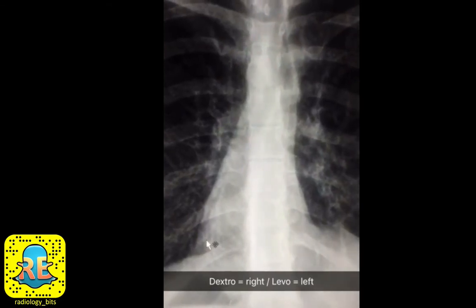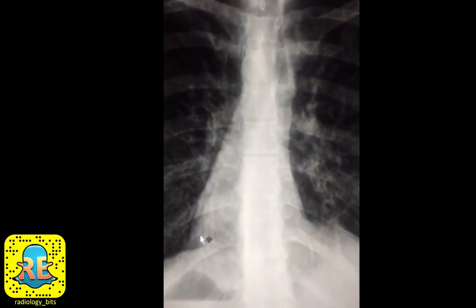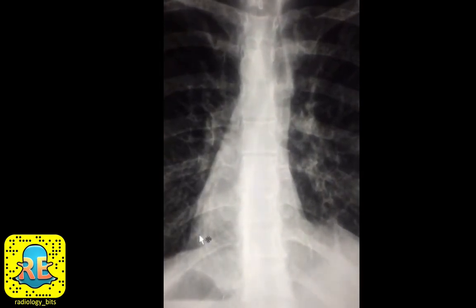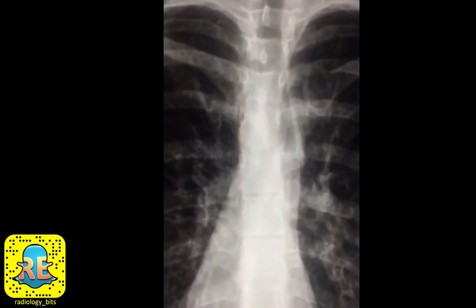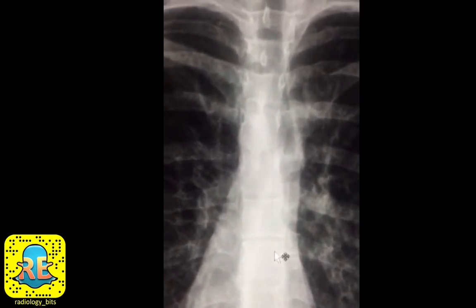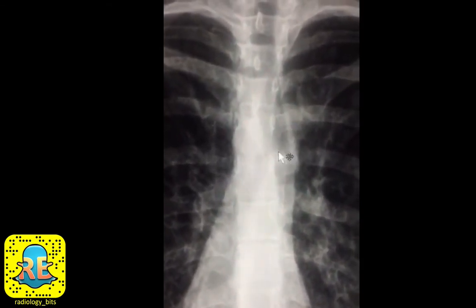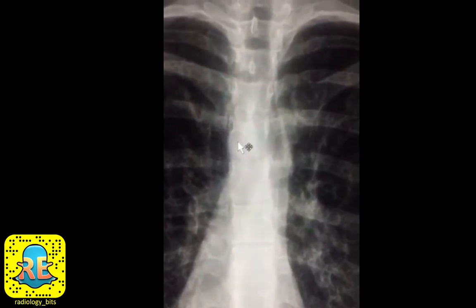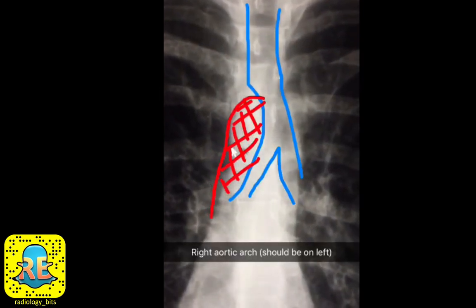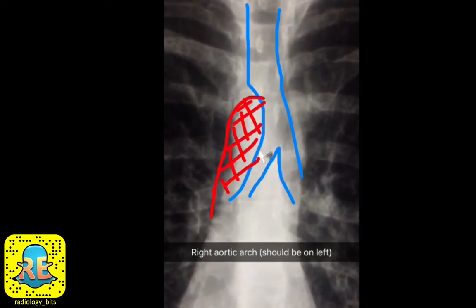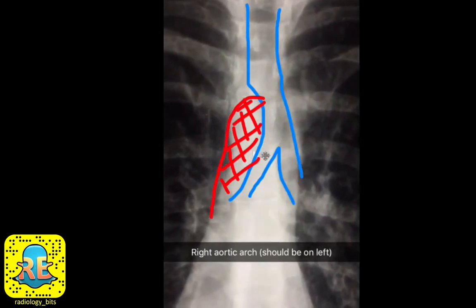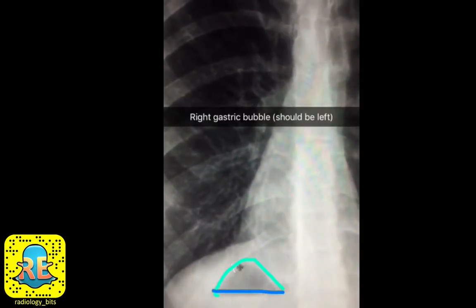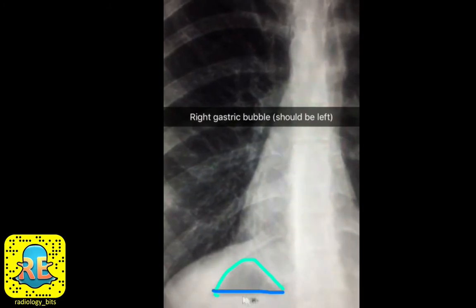In medicine, dextro means right and levo means left. Normally the apex should be on the left, which we term levocardia; if it's on the right, as in this case, it's called dextrocardia. Another finding is that the aortic arch is not present on the left — instead you see the aortic arch bump on the right side. This right aortic arch can also be confirmed by its impression on the tracheal air column, where you can see a small impression in the dark air column.